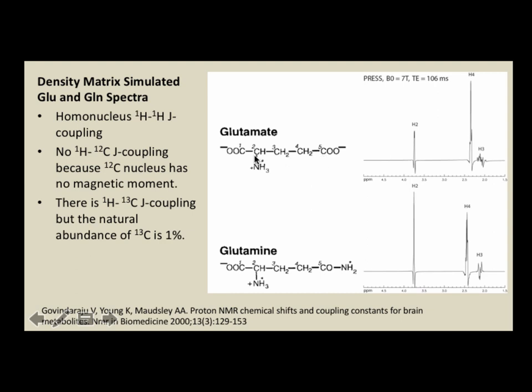So the carbon at one site will be called C1, the carbon at the second site will be called C2. Then the protons at those carbon sites will be called, let's say, H2, H3, H4. There is 1 H2 proton, 2 H3 protons, and 2 H4 protons.